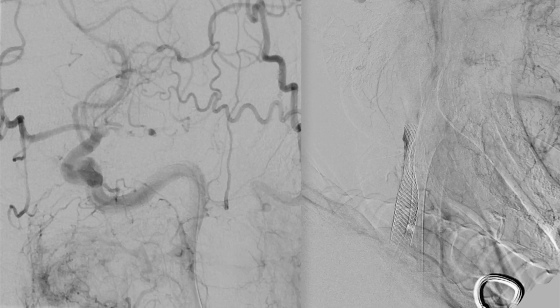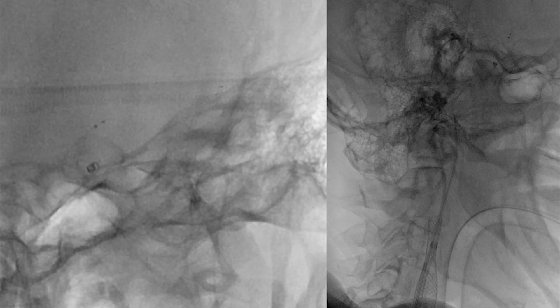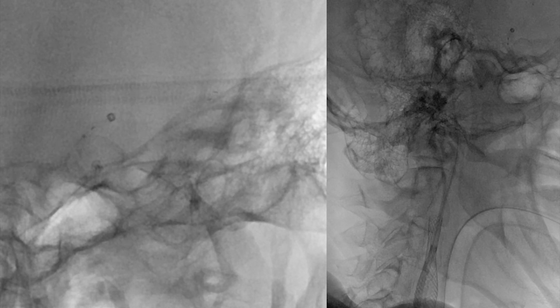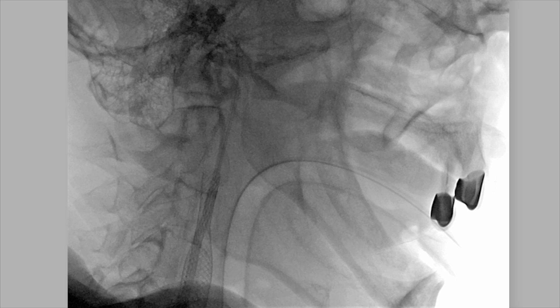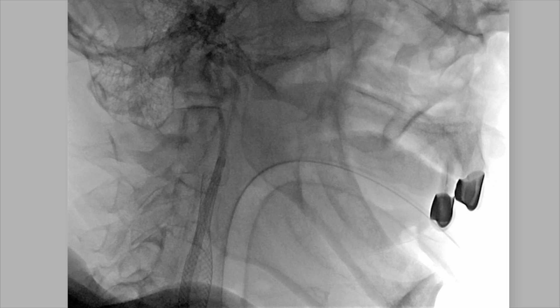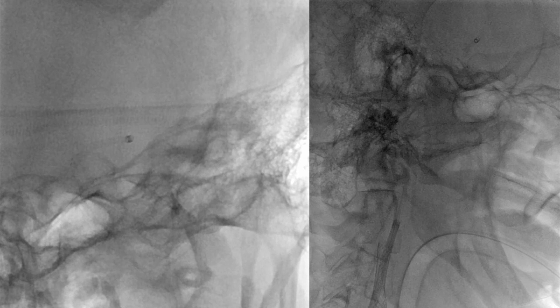The next step is to push the aspiration catheter toward the face of the clot under aspiration — we always do this under aspiration — and also advance the guide catheter distally past the cervical stent. This ensures that when you perform the SAVE maneuver for the intracranial LVO, the stent retriever doesn't get caught on the carotid wall stent. We then apply aspiration on both the distal aspiration catheter and the guide catheter in the cervical portion of the carotid, and retrieve the whole unit — stent retriever, clot, and aspiration catheter — under proximal aspiration on the carotid guide catheter.